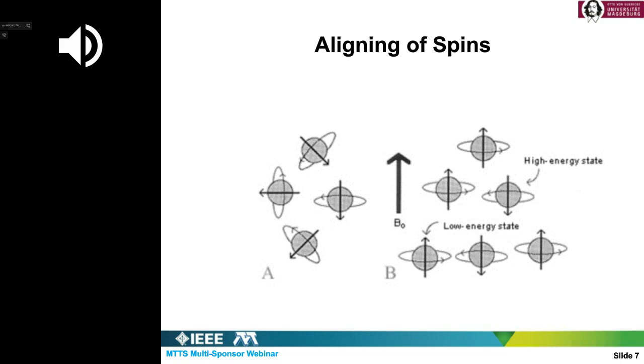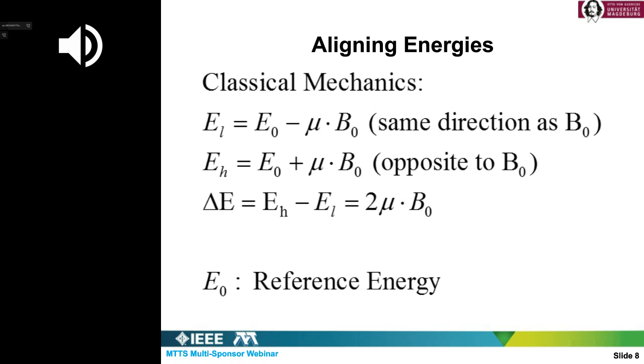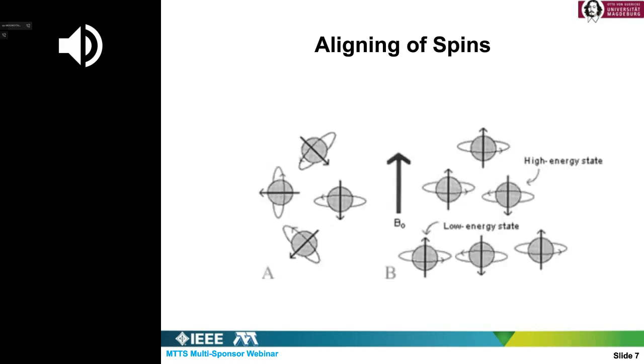Of course, if you measure something from outside, let me come back. You will measure the net. So it is actually the parallel minus anti-parallel. And this is actually very, very small.